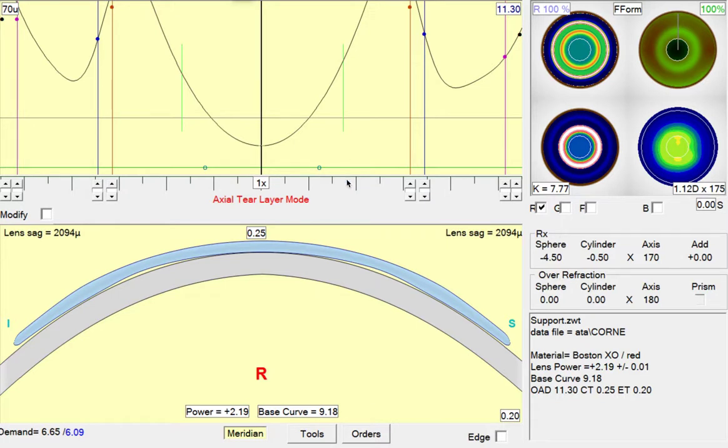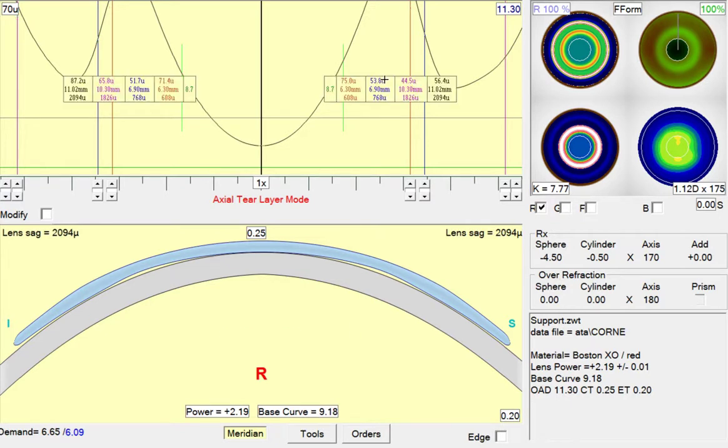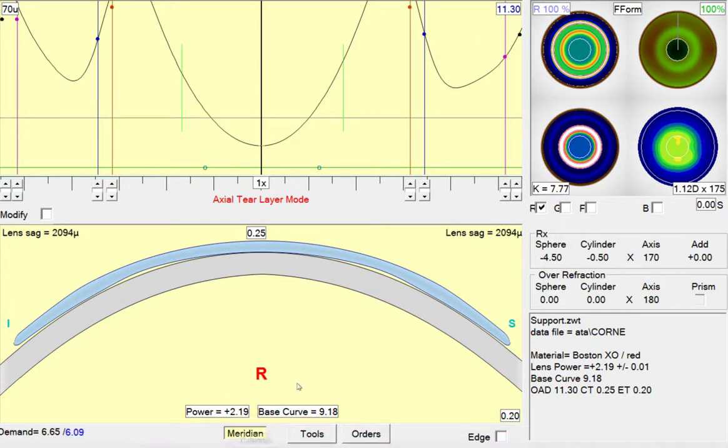So the first thing we'll do is switch this lens to GSYM and we'll do that through the tools menu, configuration settings. So I'm going to see what the parameters are currently, 6.3, 6.9 and 11.3 diameter.